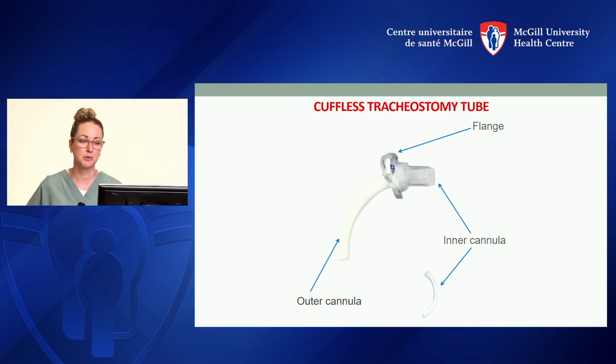It's basically for patients who are able to breathe on their own and don't require any mechanical ventilation. The patient has to have an effective gag and cough reflex to prevent him or her from aspiration. It is also a safety reason why we change patients to a cuffless tracheostomy tube. If they're going to one of the units and they don't require mechanical ventilation, we will change them to a cuffless tube, because secretions can tend to accumulate around the cuff in the trach, even if it's deflated, which increases the patient's risk of occluding and blocking their airway.